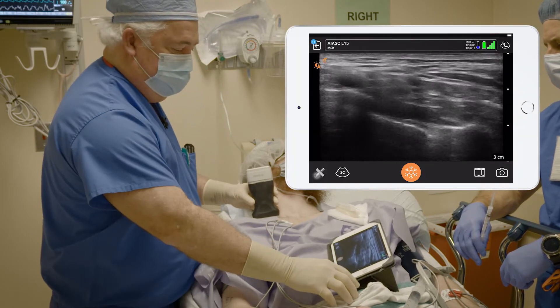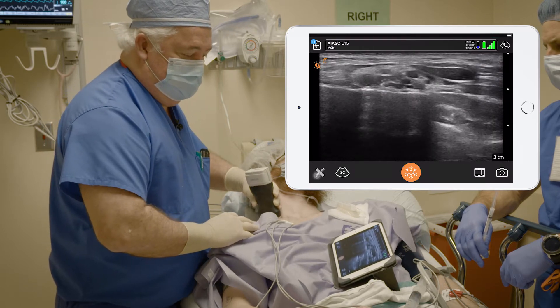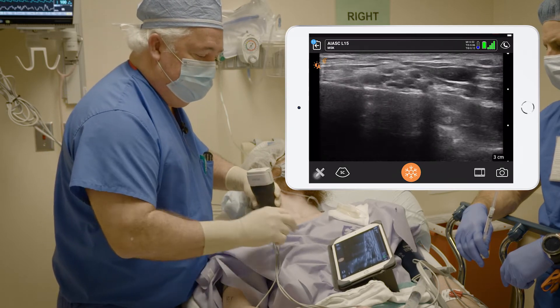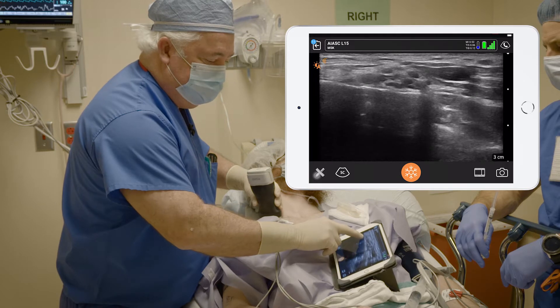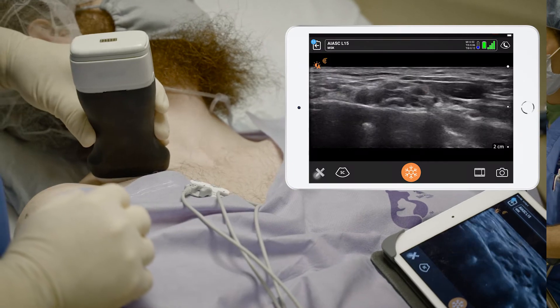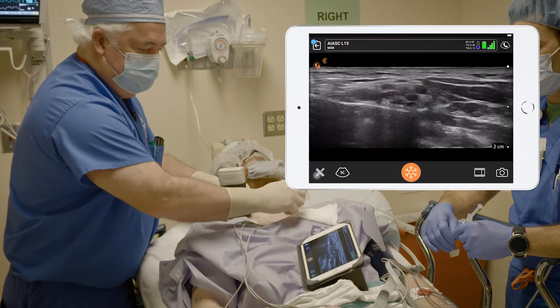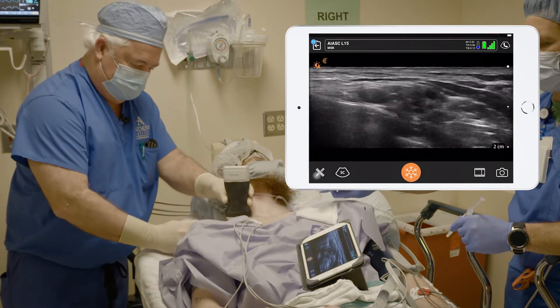There's his artery. Get a good look at the rib. It's kind of deep right now, so it's real easy to change the depth on the screen — just pull down. There we go. We just want to come in into the corner pocket here underneath and get him numbed up.